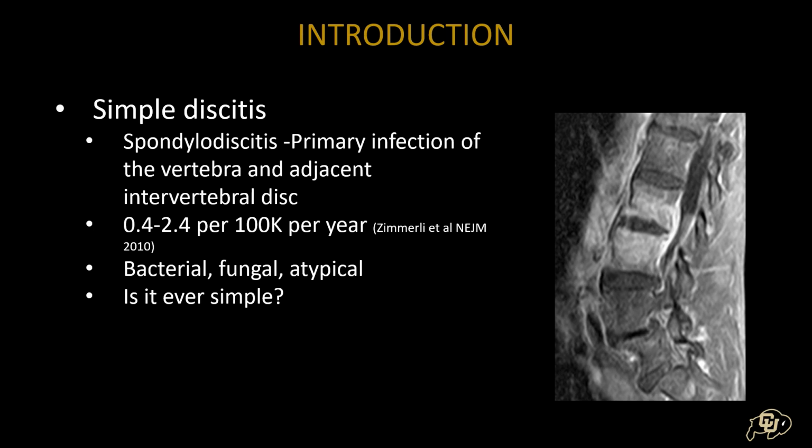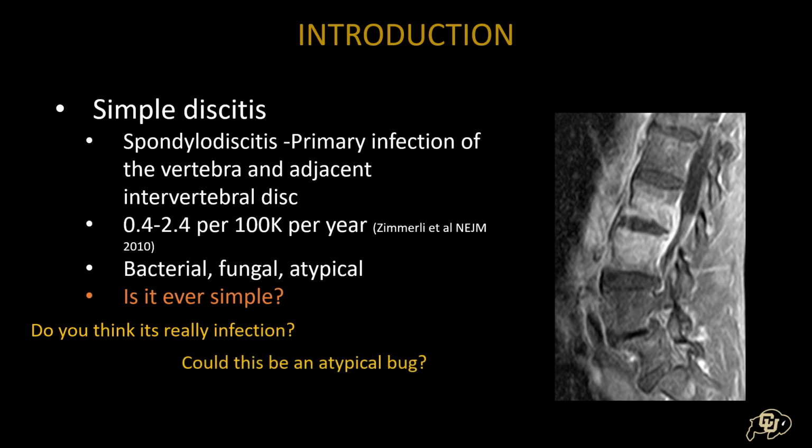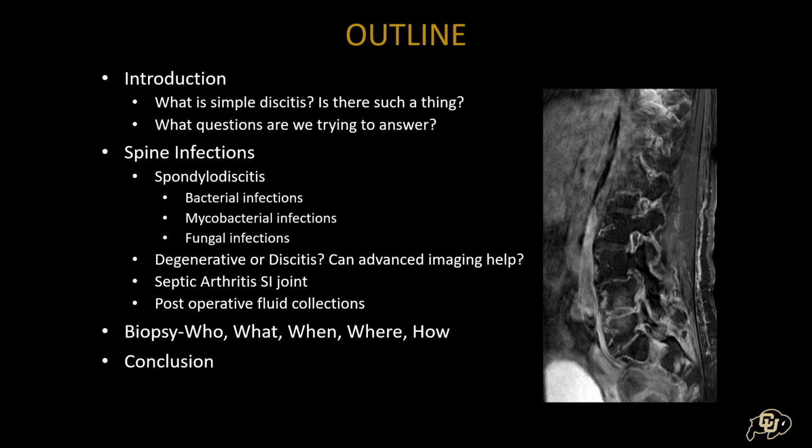It has a pretty significant incidence in the United States, but I have a little bit of an issue with this concept of simple. The reason being, I get calls just about every single day to revisit the imaging on these patients and answer the questions: do we think it's really infected? Could this be some kind of atypical bug? And is our treatment working? So the goal of this talk is going to hopefully give you the tools that you need to answer these questions more accurately and efficiently for your referring clinicians.